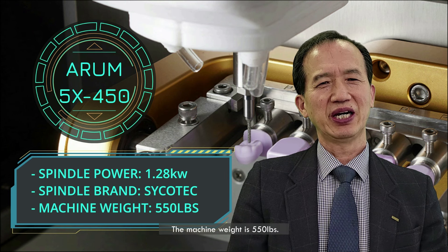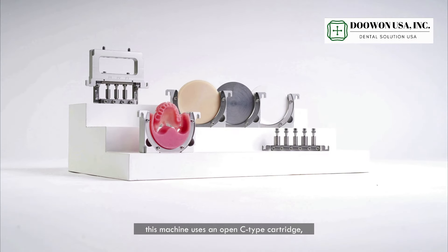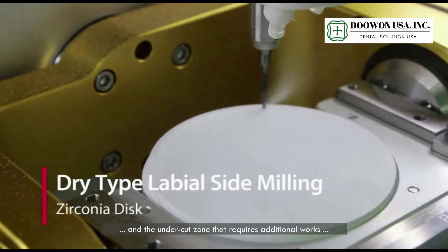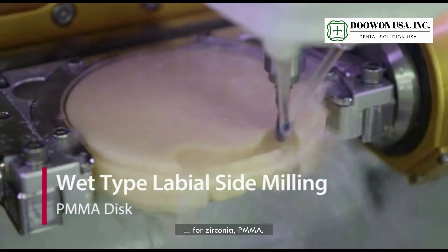The machine weight is 550 pounds. Particularly, this machine uses an open C cartridge, so you can mill more precisely the labial side, buccal side, and the undercut zone that requires additional work for zirconia and PMMA.